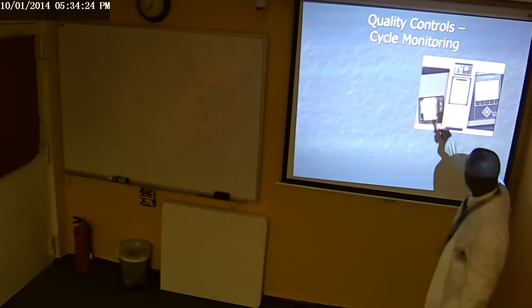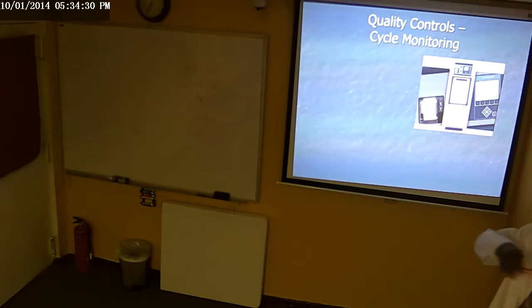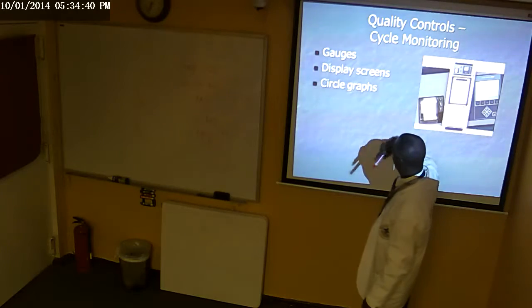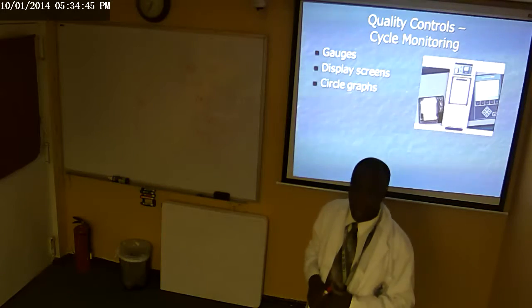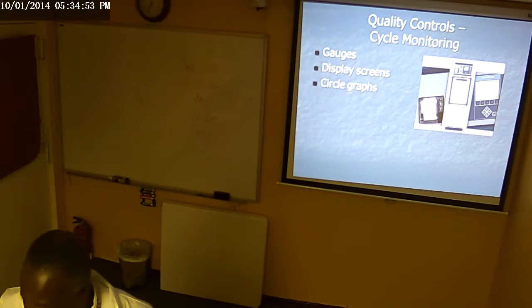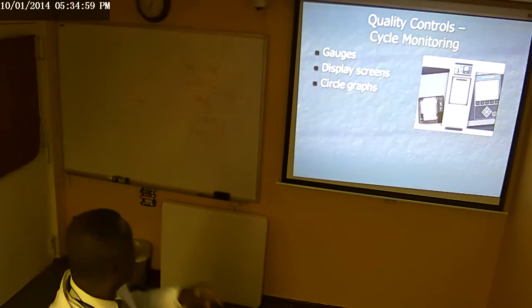See this example here. As the process goes into the printing, it gives you data, the cycle data. This is what I was talking about. These are all mechanical; it's part of the mechanical. The gauges will be measured. We have two types of gauges. We have the jacket gauge. I'm going to go over it quickly, and you'll understand more when we move to the next chapter, because it's going to eat all my time. But we have gauges.